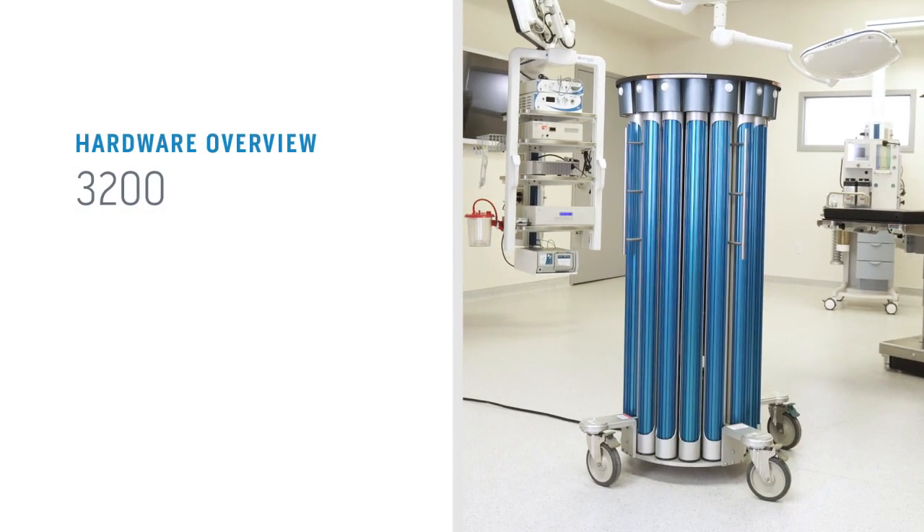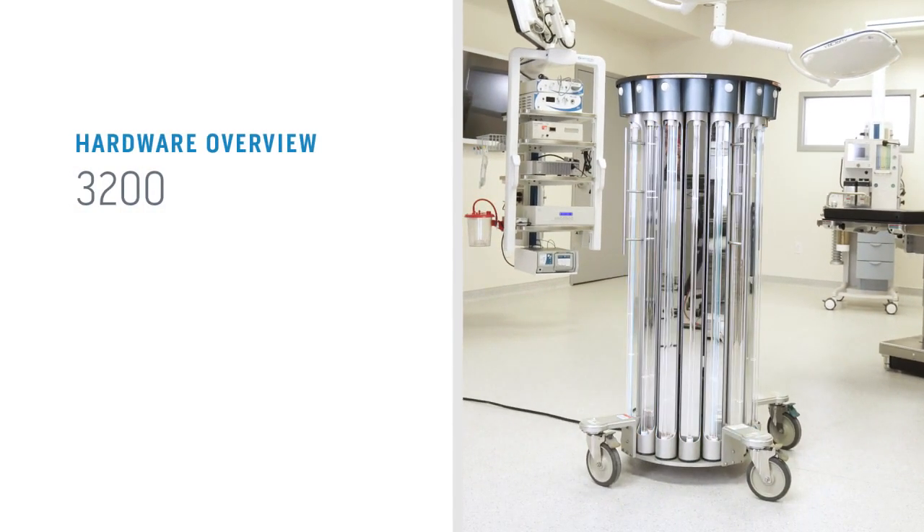On the 3200 model, rotating aluminum shutters protect the lamps. Our field balancing technology will turn three lamps off during any given treatment to focus UV energy where it's needed most — to the larger expanses of the room.